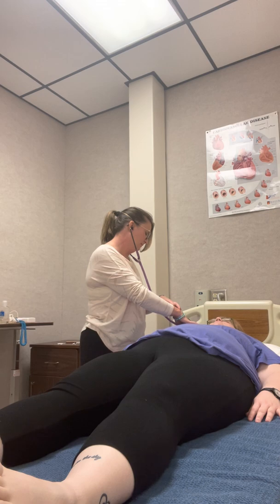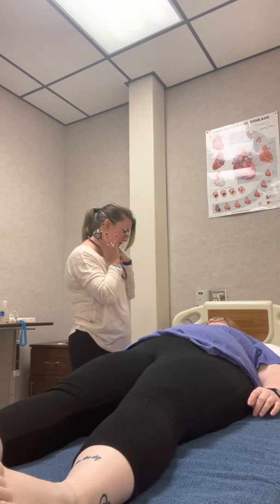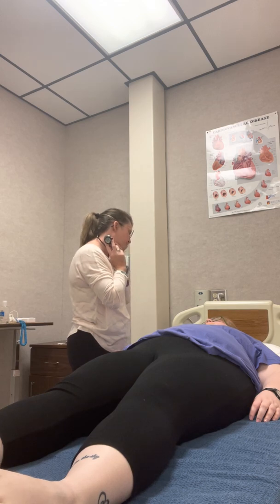I stopped hearing that at 80, so I gotta pump 30. Okay, not that I don't trust it, but now I don't trust it. I said 70. The cord is really stiff, so I think that's it. Do you want me to hold that? Actually, now I got it. Okay. Good. You're 64. Nice.